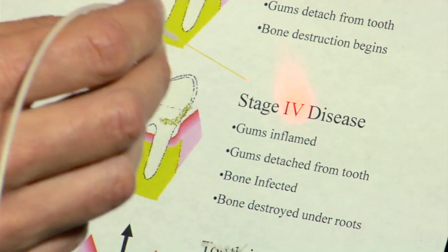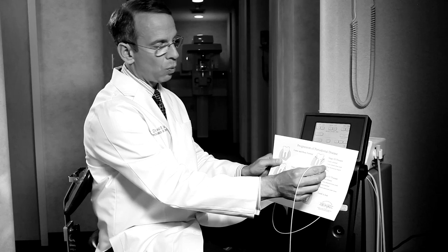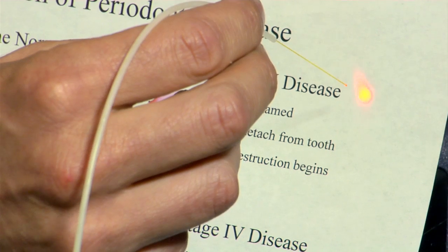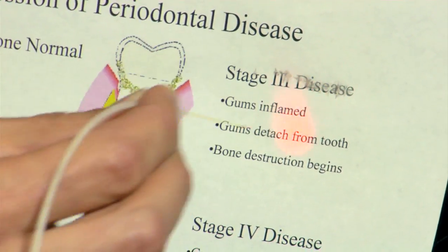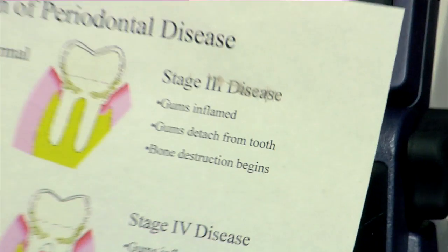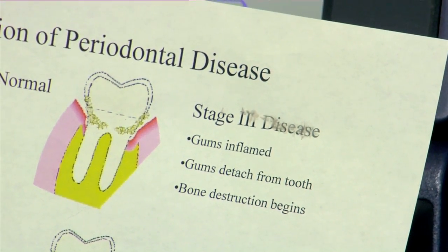We use this beam for pointing. Watch as I fire the laser — the laser doesn't interact with the white paper at all. Now watch as I bring it over the black lettering. You see that popping? Each pop represents the laser interacting with the toner on the paper. The laser only removed the toner but did not disturb the paper underneath.